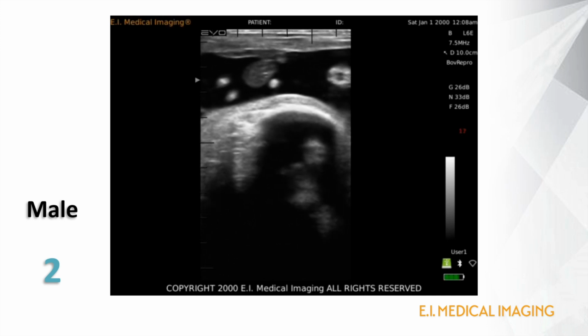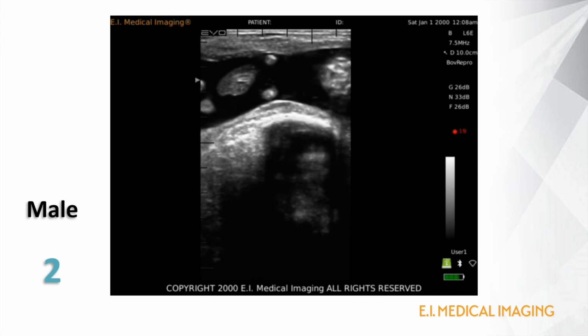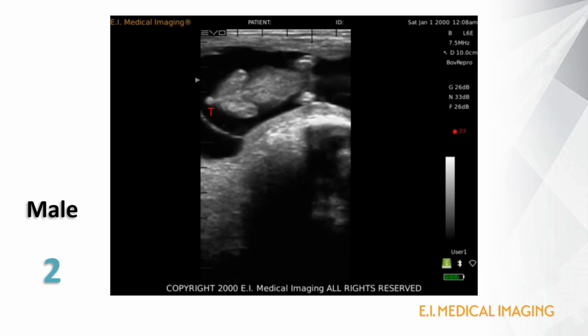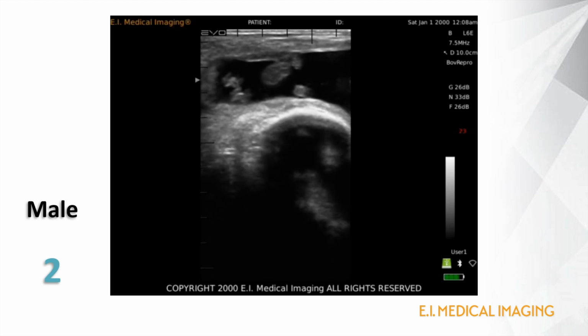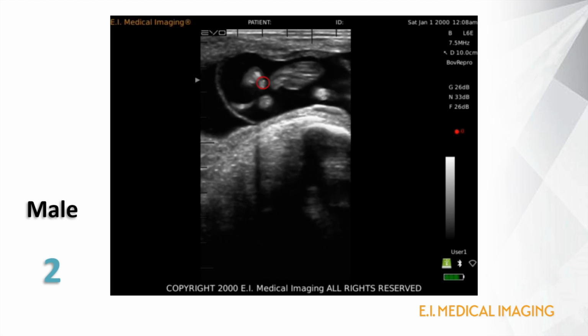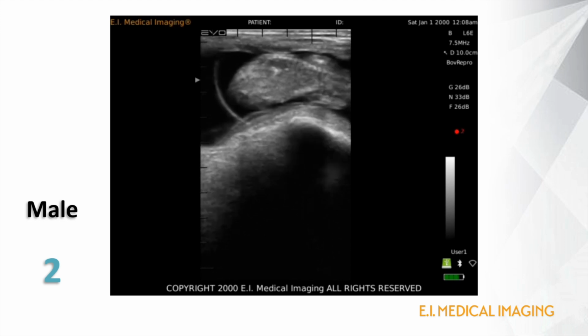This is a good example of an image where the dense fetal bone of the tail could be mistaken for a female GT. But if you fan through the fetus repeatedly, it's clear that there's no distinct structure at the back end, and that the male GT is very obvious on the ventral abdomen adjacent to the umbilicus. This is a bull calf.